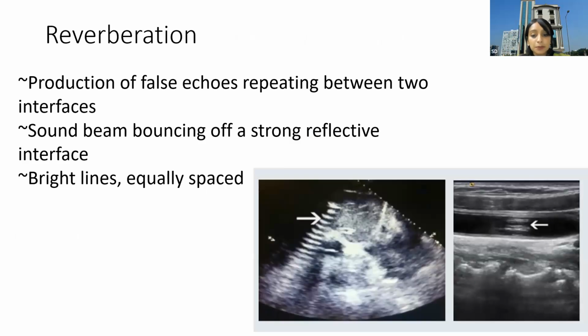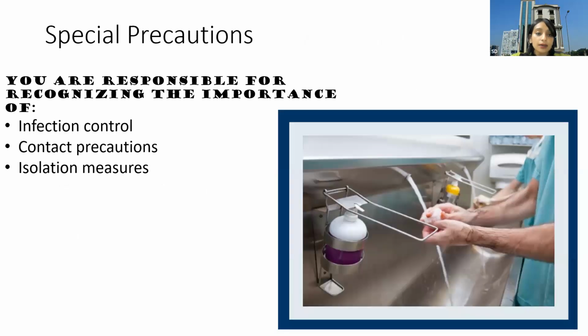Next is reverberation, the one that we were talking about. If we are seeing multiple structures getting reflected from the needle which is being placed onto the patient, we call it reverberation.